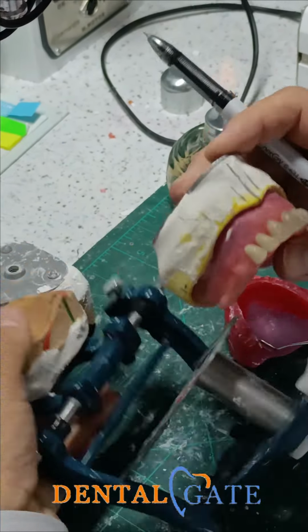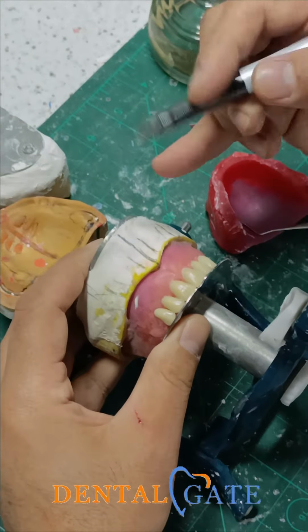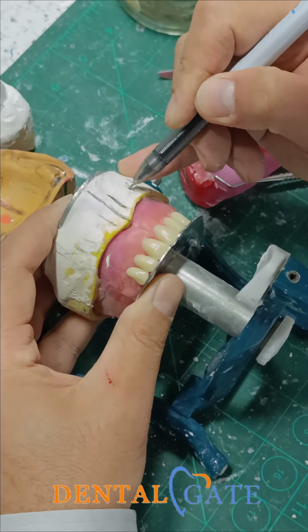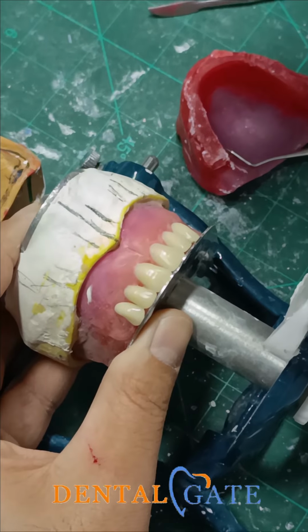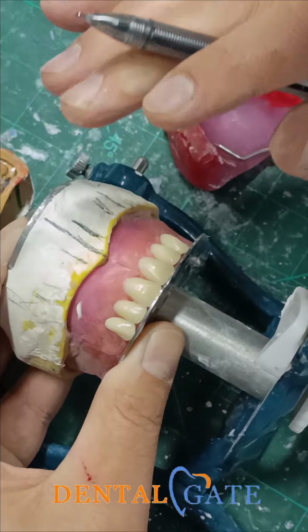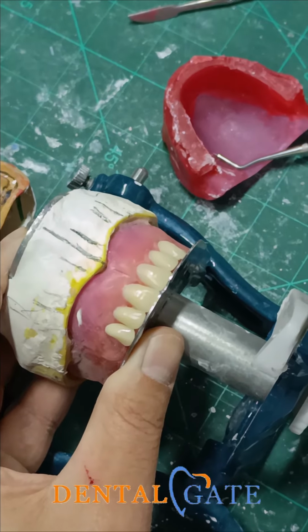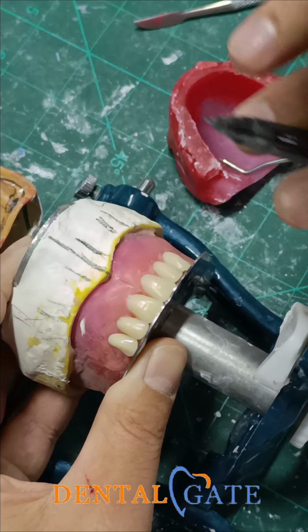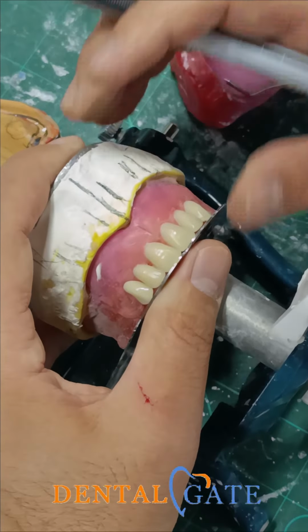So regarding the lateral incisor, this is the long axis, it should be vertical. The lateral incisor may have a little inclination, okay? But my recommendation, don't make an inclination to the long axis. You can make it, but we may use it within the lower if we need it, okay? Make an inclination distally. But please, this is the mandatory one.